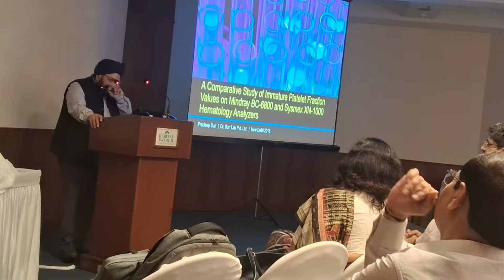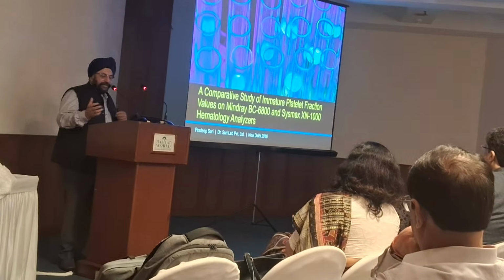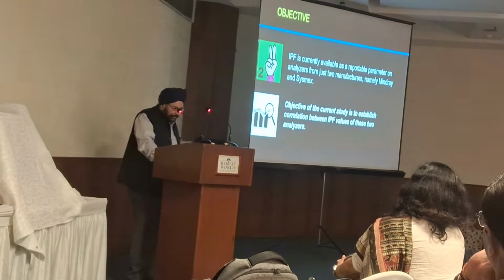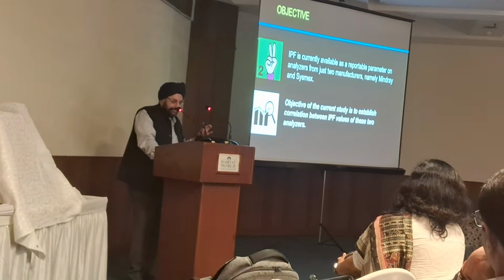Then we did another paper in 2016 where we were comparing 2 different analyzers, Mindray and Sysmex, and seeing whether IPF value trends change between these 2 systems. This study I had done jointly with Medanta Hospital since I don't have the Sysmex system.